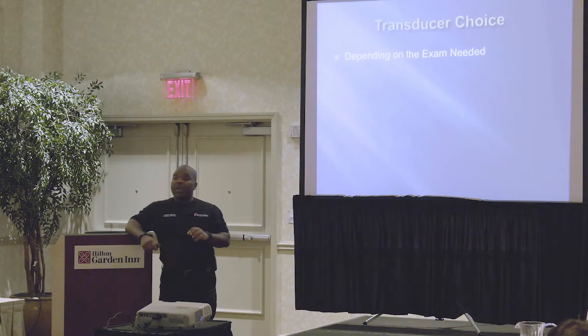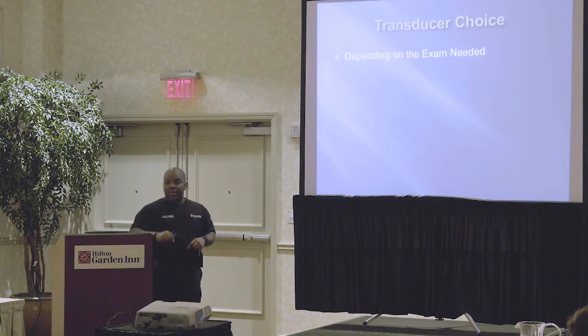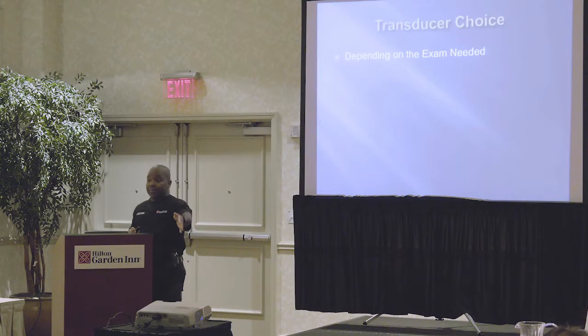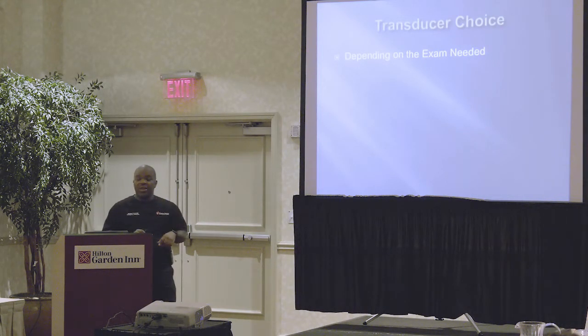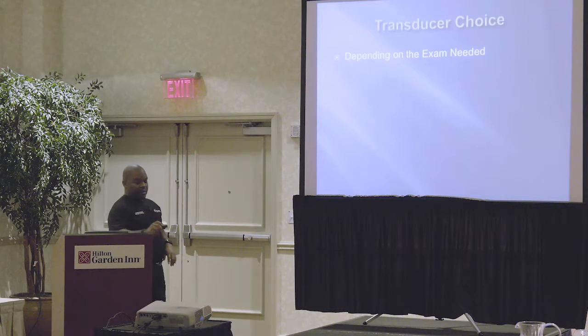When I'm looking for the gallbladder, or a pregnancy inside of a woman's uterus, then I'm going to use the slower transducer, the one that's going to go deeper. That's going to be my long distance runner. So I would choose the 5-3. Does that make sense? The lower the number, the slower, and the further it's going to go. So for solid organs, choose a transducer that goes deep, low number. For superficial structures, choose your transducer that's going to go very fast, so your higher frequency. That's the basic thing to think about.